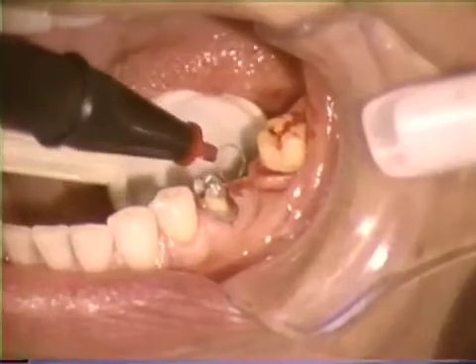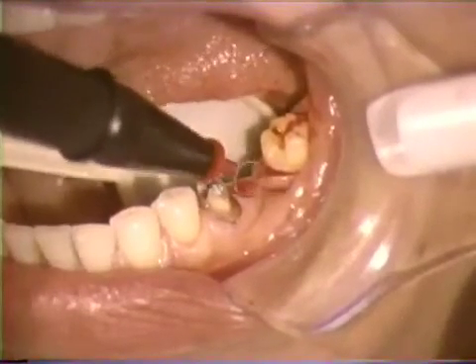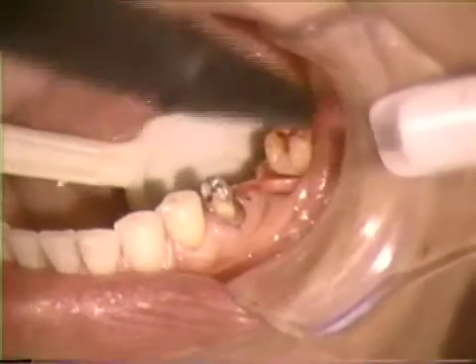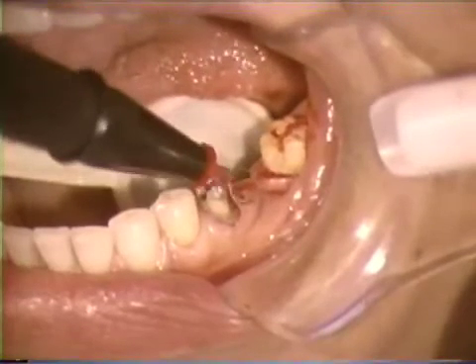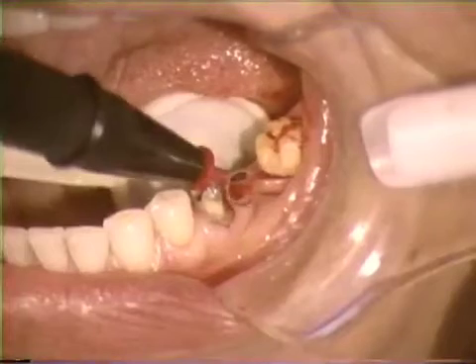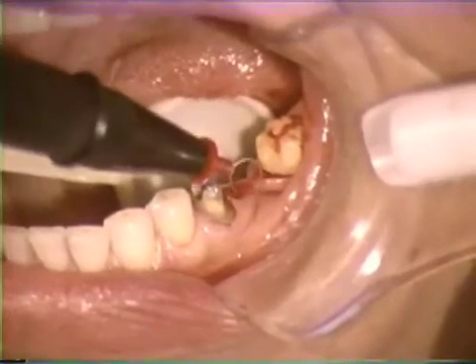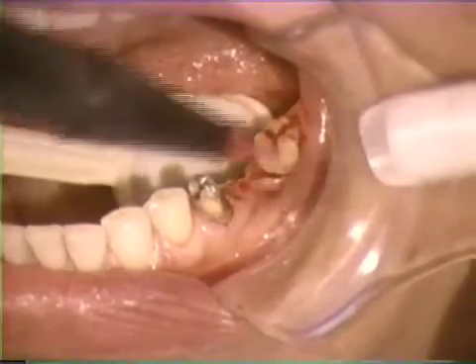Some oozing of blood is normal and desired during electrosurgical procedures. Just as the cut tissue should not adhere to the electrode, remaining tissue must not become coagulated or white. Significant and harmful tissue alteration will occur if the electrode is moved too slowly during cutting or if the current intensity is set too high.